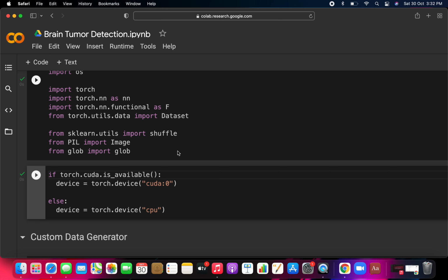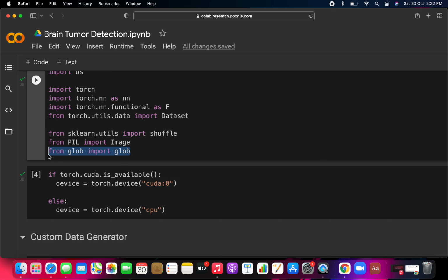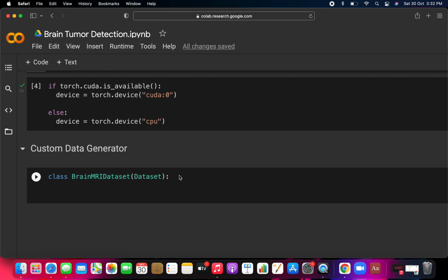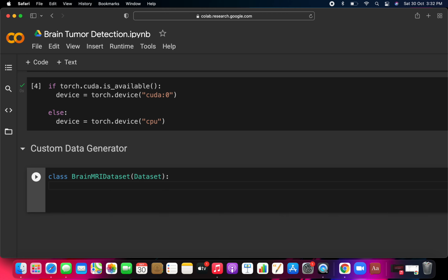In that one folder you may have JPG or PNG images, different image formats. If you want only the JPG images and not the PNG images, you can use glob. It iterates recursively. We will look at this whenever we build this particular class.